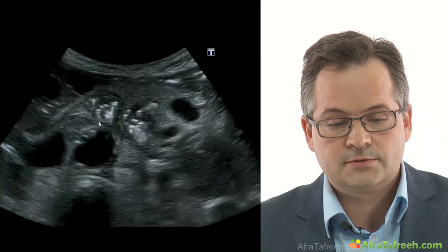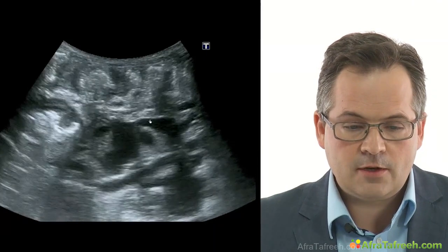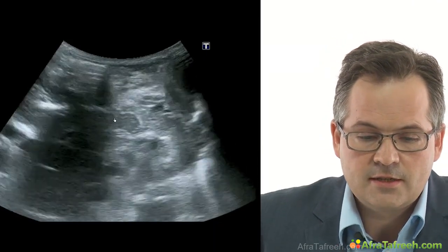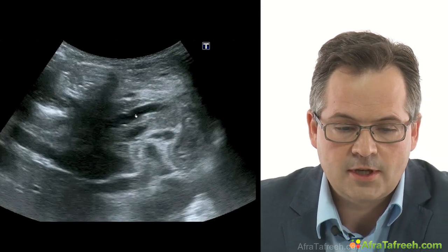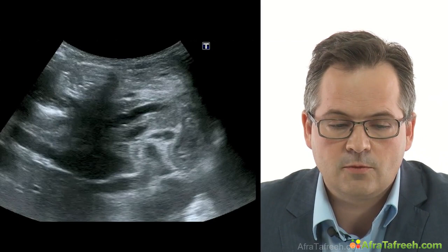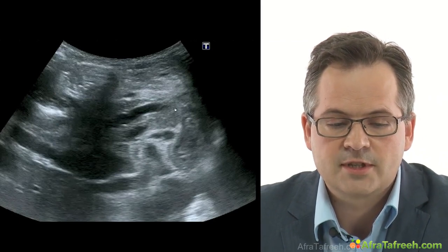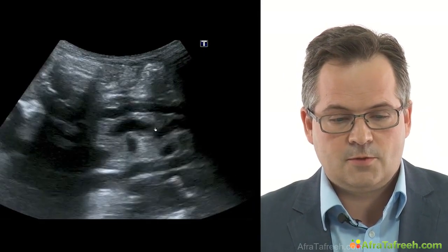Calcification over here, dilated pancreatic duct. Here you can very easily see the tubular structure again. I stop the video over here, and you have this tubular structure which exceeds almost 5 to 6 millimeters in the case of a chronic pancreatitis. Do you know what this structure is?